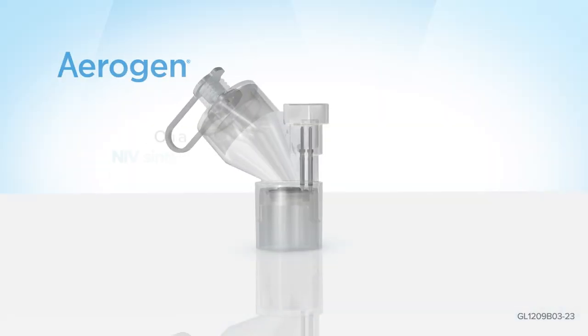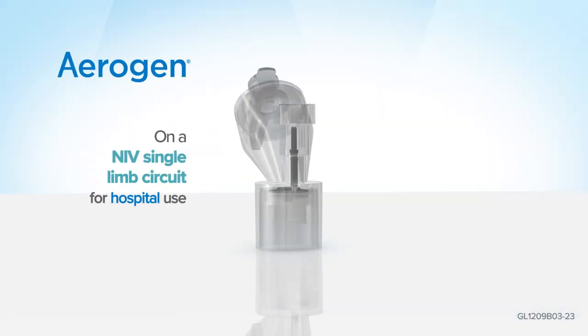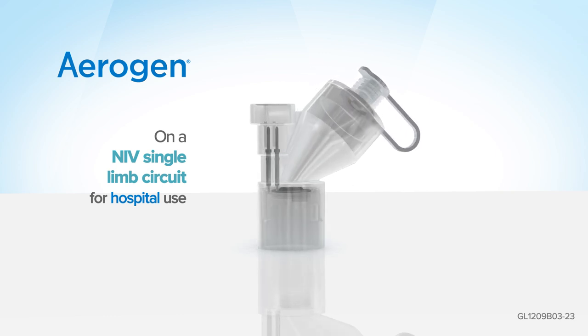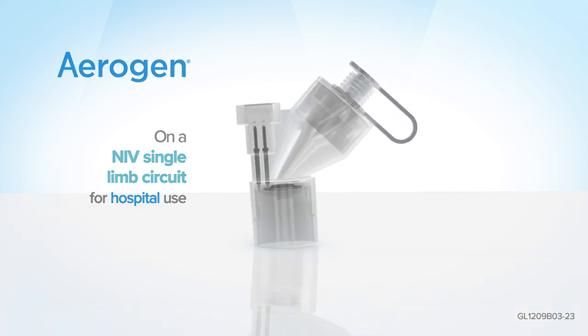This is an example setup of Aerogen on an NIV single limb circuit for hospital use. Please consult individual manufacturers' instructions for use, as setups may vary.